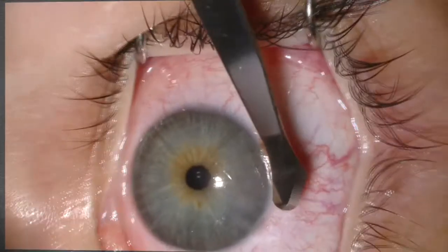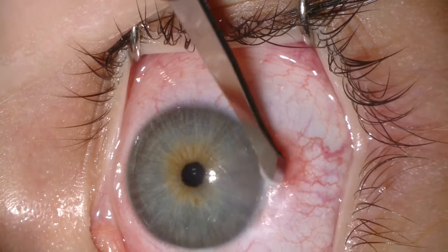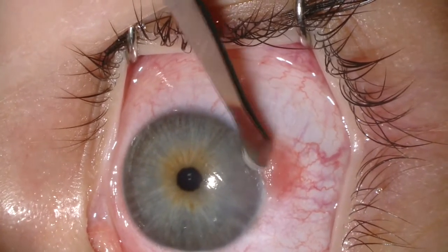We use the corneal epitheliectomy technique to obtain tumor-free margins on the corneal side. With this technique, we use a 57 beaver blade. I like to use the toe or the base of the blade, carefully lifting the epithelium off Bowman's membrane.